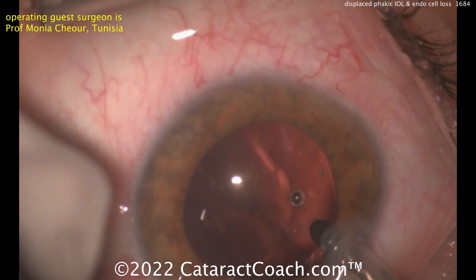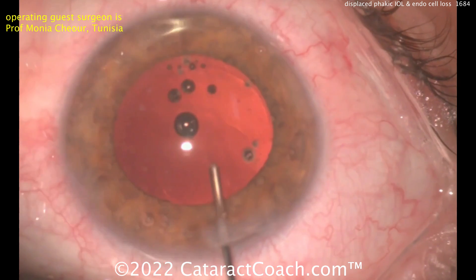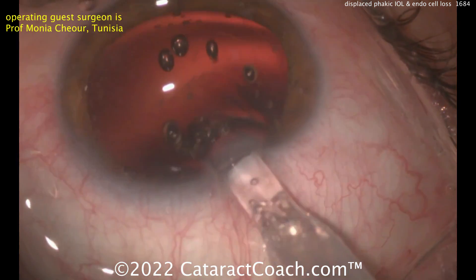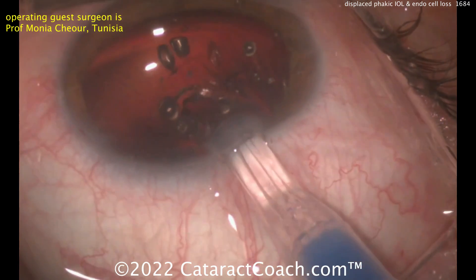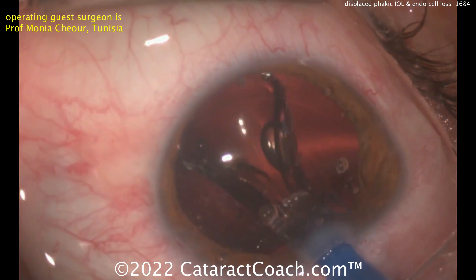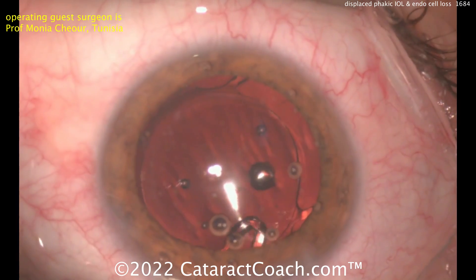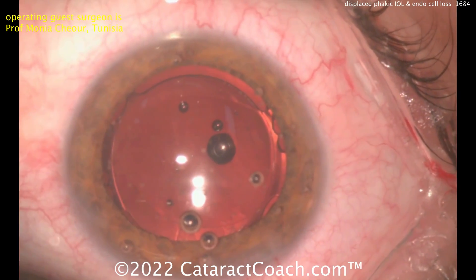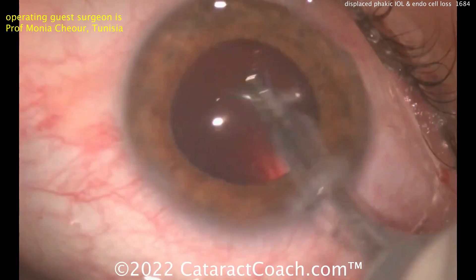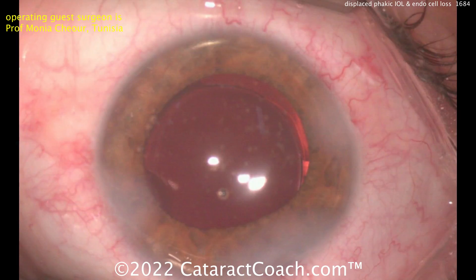Interesting case — I have not seen a case like this before where in just one year a newer design phakic IOL has caused this degree of endothelial cell loss due to mispositioning. A regular IOL is going in the capsular bag — it looks like a single-piece acrylic monofocal design, so probably aiming for about plano in this eye. The other eye with the phakic IOL is nice and stable and doing great with a good endothelial cell count, and that eye can handle accommodation for near work for now. Great case — thank you so much for sharing.